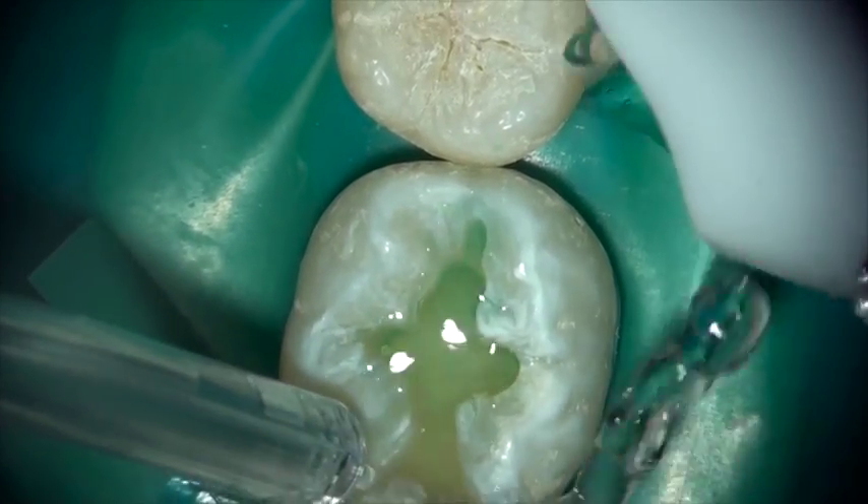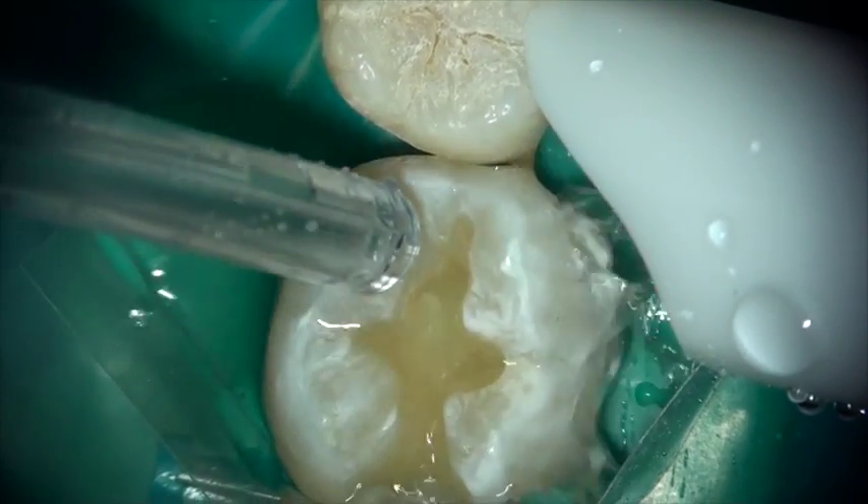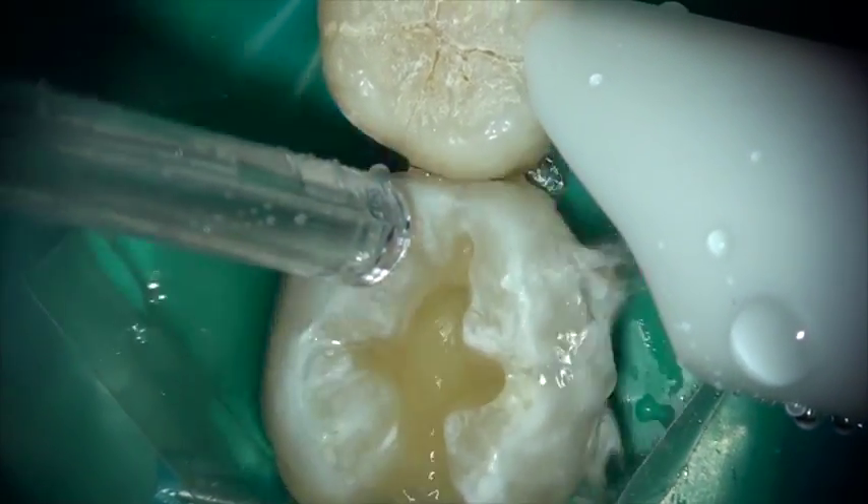Wash the material off and allow the tooth to remain slightly moist while placing the Equiaforte.